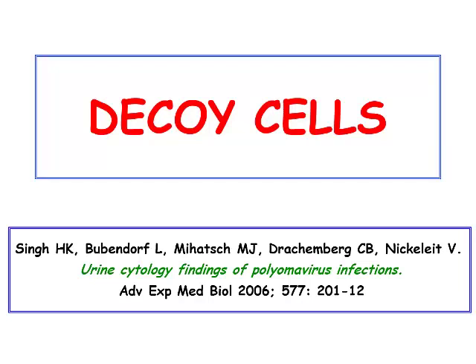And he found that a number of workers actually had in the urine cells which were similar to the cancer cells. But in the end, they found that those patients did not have any cancer. So he called those cells decoy cells, like the ducks which are used to call the true ducks when one is a hunter of ducks. So decoy cells means cells which in some way, for their morphology, remind of transitional cancer cells.